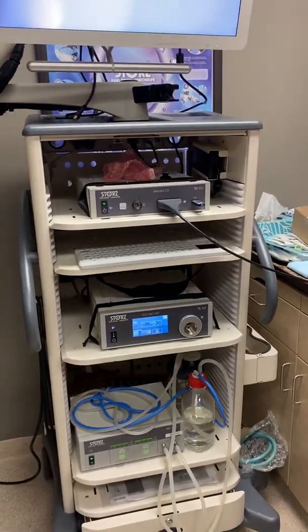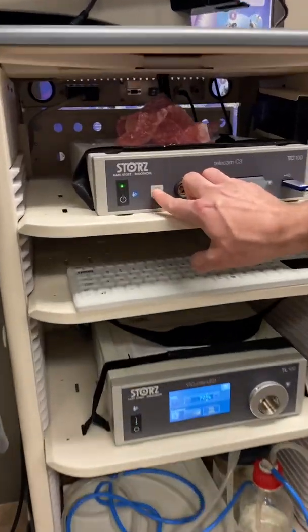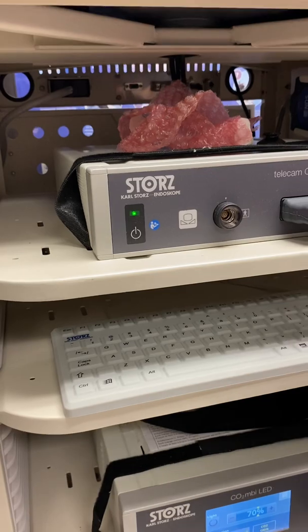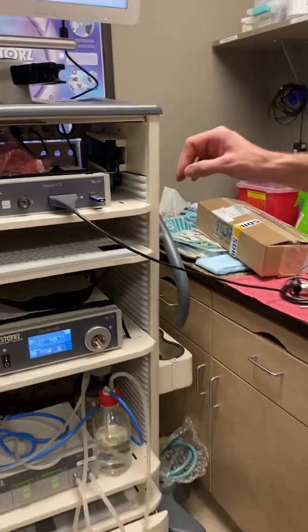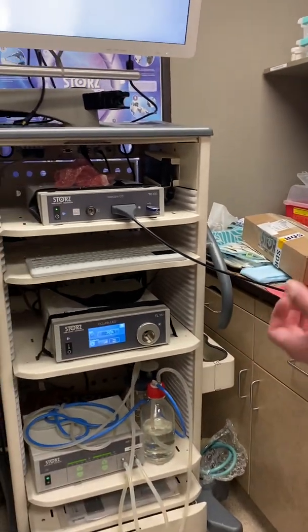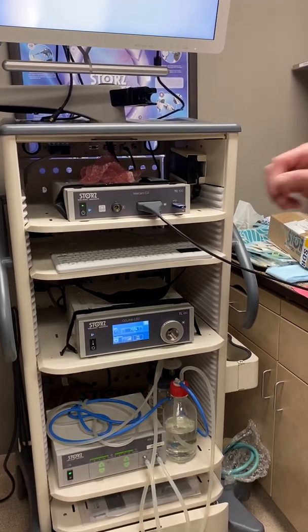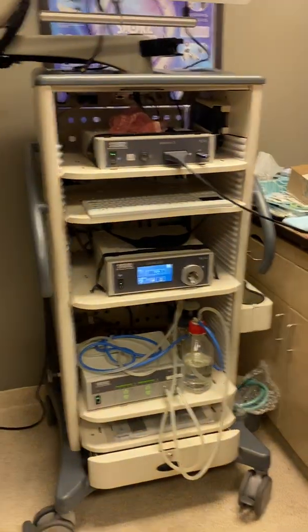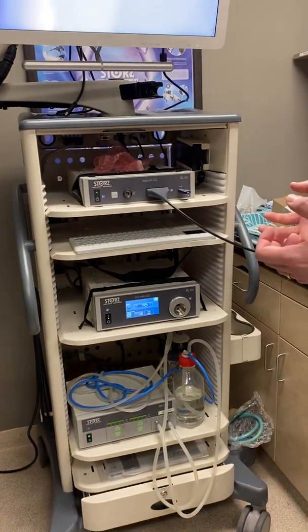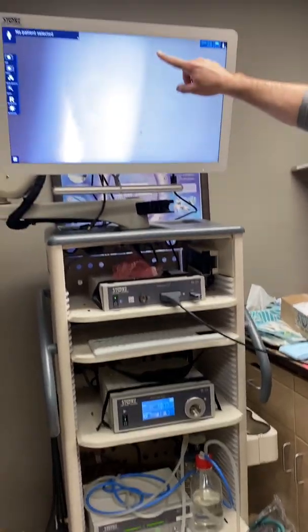White balance — there are a couple of ways to do it. One way: you'll see a white balance icon on the camera box. Hold the scope up to something white, typically a cotton swab, and click that button. It will tell you it was performed successfully. If it's not white enough or something's off, it will say 'retry' instead.